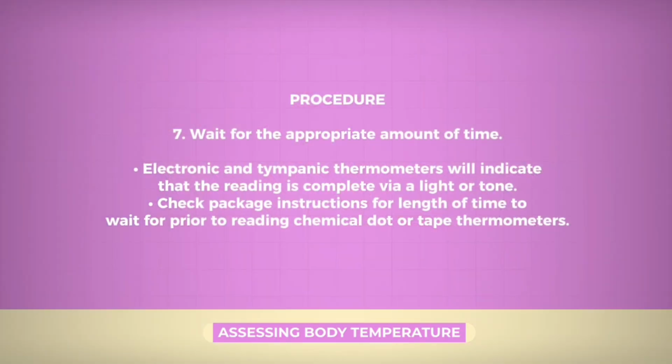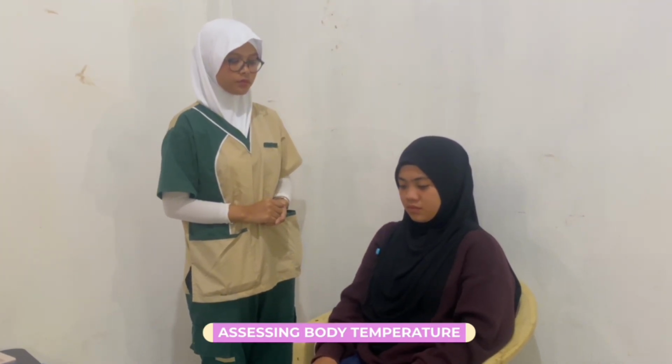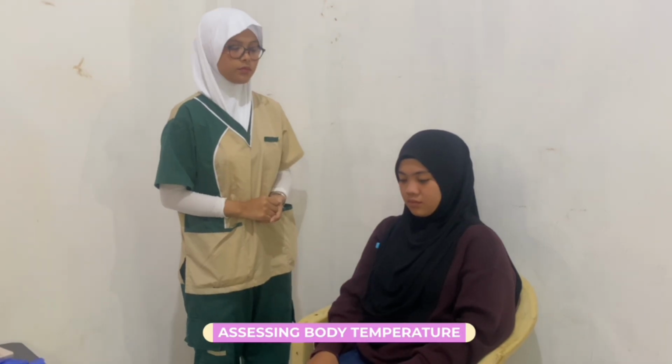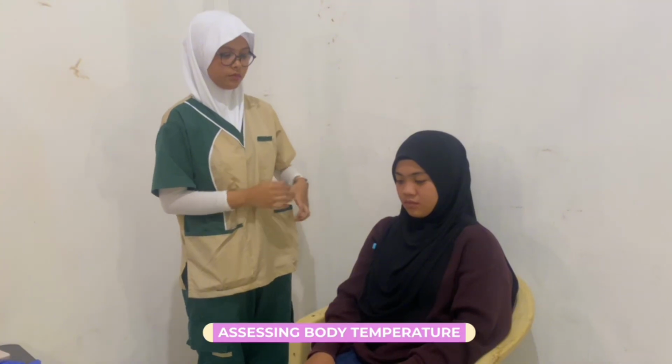Then wait for the appropriate amount of time. Allowing sufficient time ensures that the thermometer accurately detects and records the client's body temperature. Electronic and tympanic thermometers will indicate that the reading is complete via a light or tone. Check package instructions for length of time to wait prior to reading chemical dots or tape thermometers.